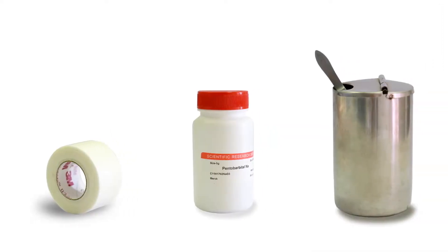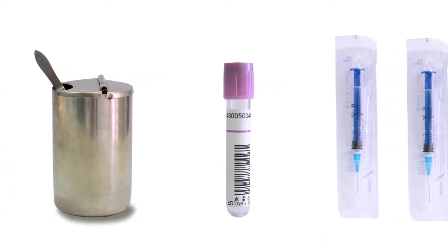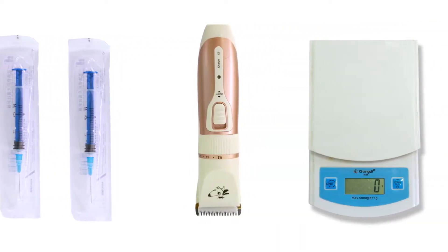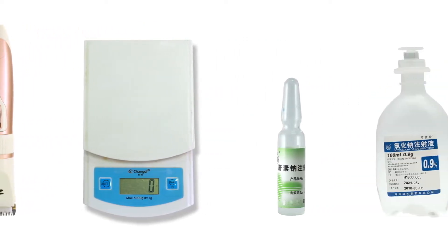To start, prepare adhesive tape, epilating agent, 75% ethanol, blood collection tube, 2.5 ml syringe, hair shaver, electronic scale, heparin, and physiological saline.